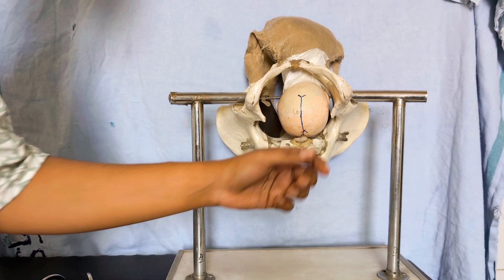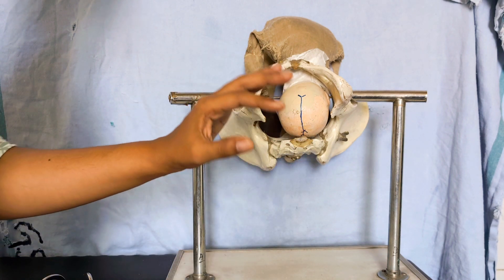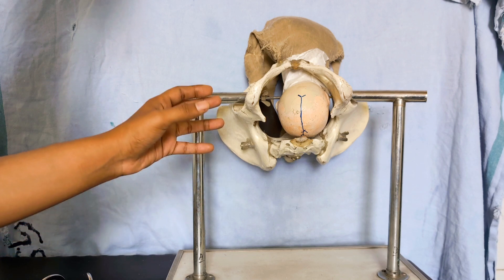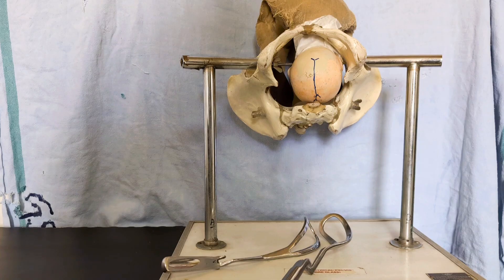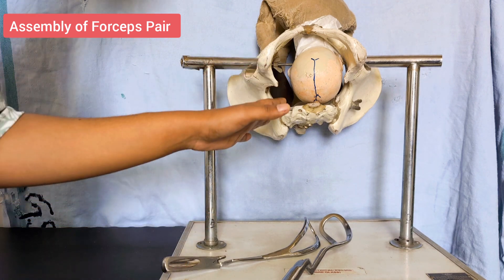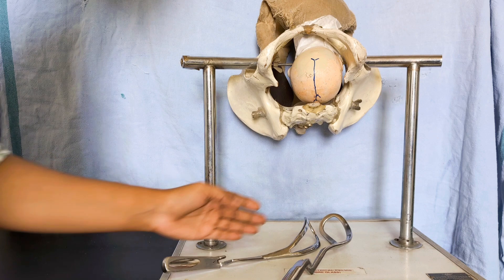The scalp should be visible without separating the labia, and the AP diameter of the outlet should be in line with the sagittal suture of the fetal head. In this case it is totally in line, or it should be at least less than 45 degrees from the midline.